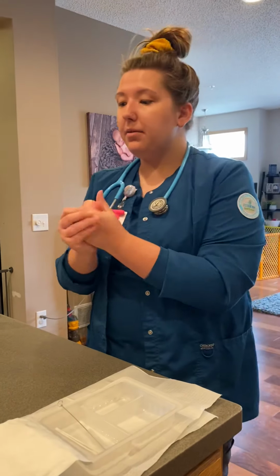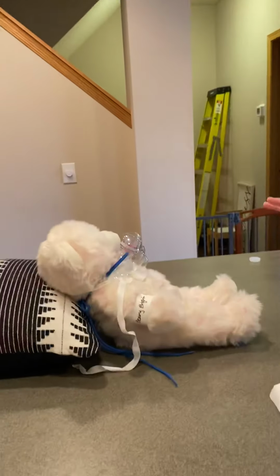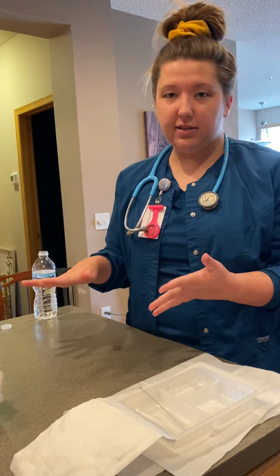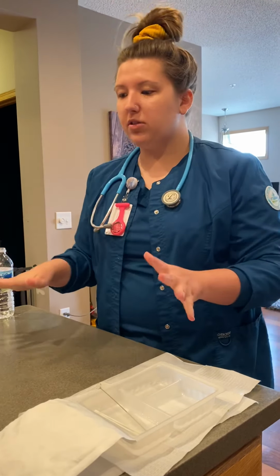So I'm going to do that and also make sure that the patient is doing okay. If anything were to be abnormal within the assessment, I could do suctioning at this point. So that's why we did the assessment. So everything is good here. I washed my hands once the procedure was over, make sure the patient tolerated it well, and now I would go back and document. So I'd want to document to ensure that my, again, patient tolerated.